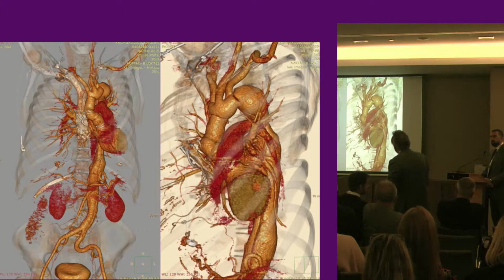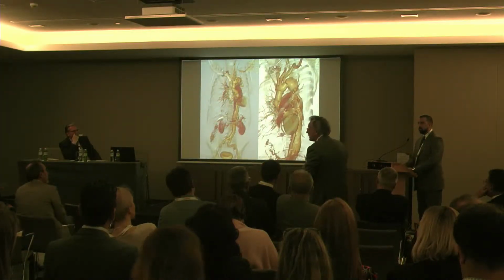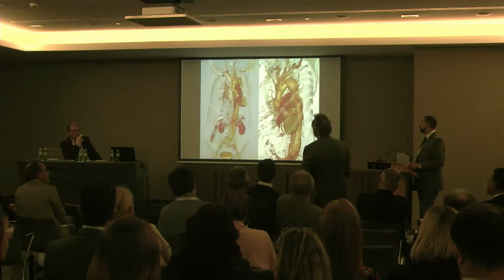So 33 years, and Marfan, I think that he requires, this is the typical dissecting aneurysm of the thoracic aorta, with reimplantation if he needs of the left subclavian artery. But sometimes it's possible to include the subclavian also in the anastomosis. If I cannot, I reimplant the subclavian artery. But why don't you do the clamp here?